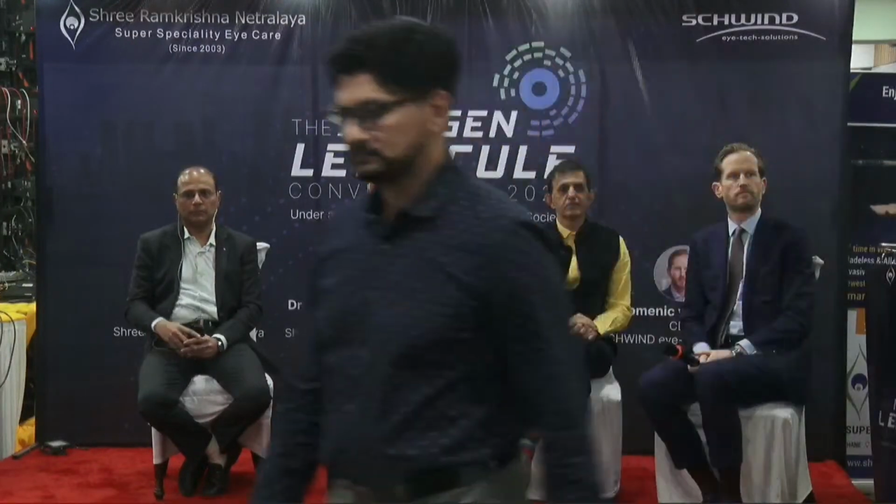Yes, with SMILE and SmartSight, yes, we do get haze. But most of the haze is due to some complication, like either some pressure eyes or you've had keratitis, something or the other. Not normal haze. Most of the haze is with PRK. Thank you.